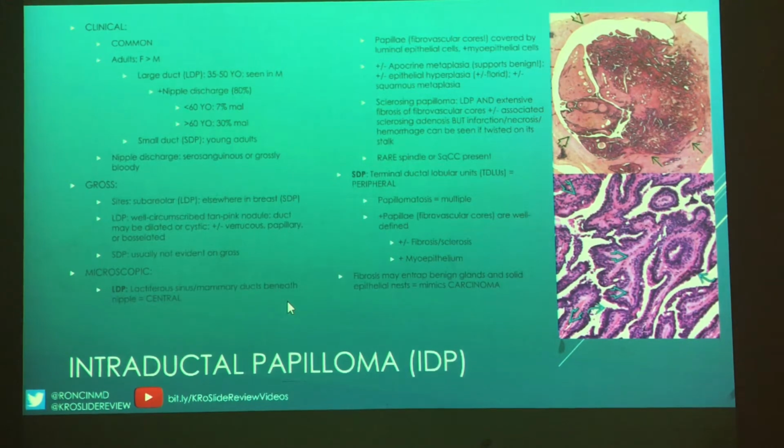And these things can be very heterogeneous, like up at the top. That papilloma has a little bit of everything going on. It's sclerosed in some parts and maybe has a little UDH in some parts. What's going on there? But you can tell it's all one lesion and it's in a dilated space. You should see fibrovascular cores, because there are papillary lesions where we won't see those. And you should generally have maintenance of that 2-cell layer.